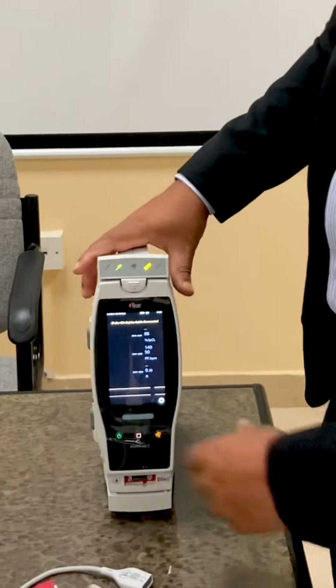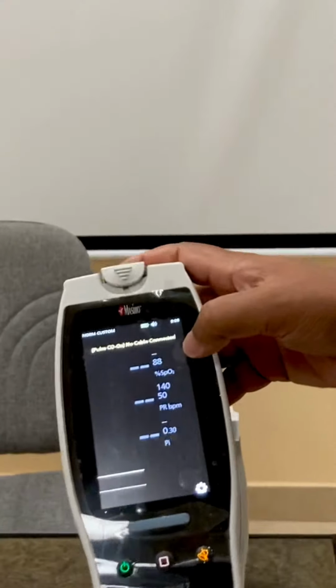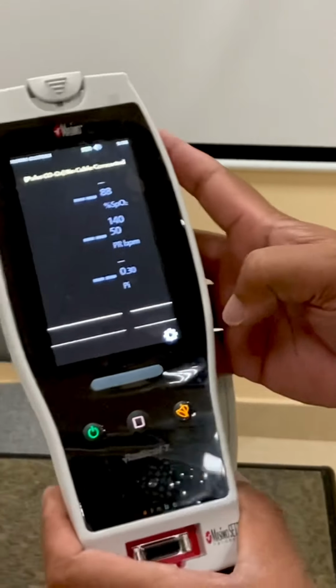Coming to the system, I'll take it out and then I'll explain it. Coming to the system, you can have the SpO2 value, pulse rate, and PI, and the pleth waveforms as well.